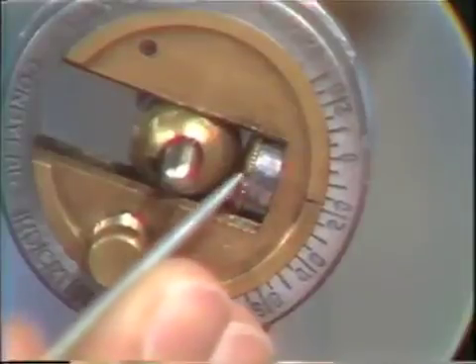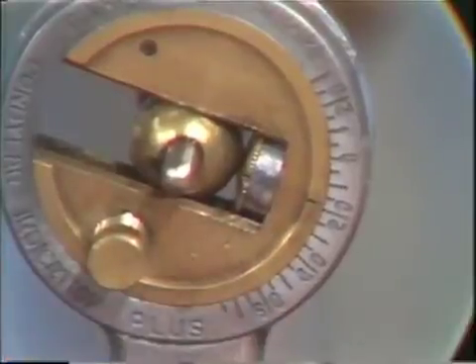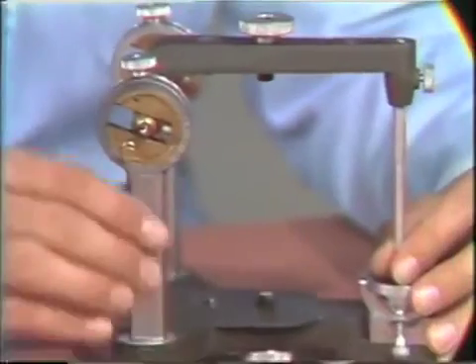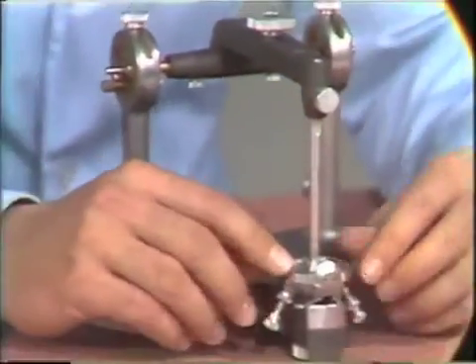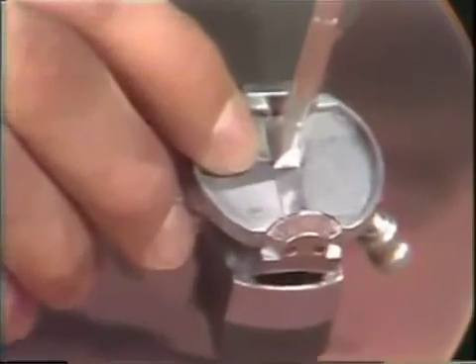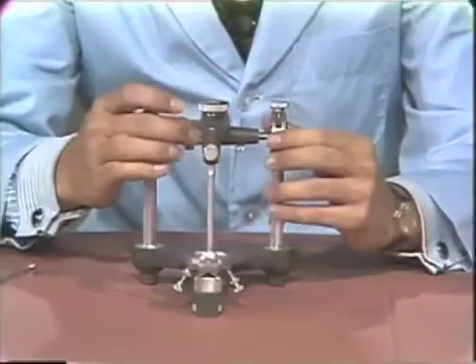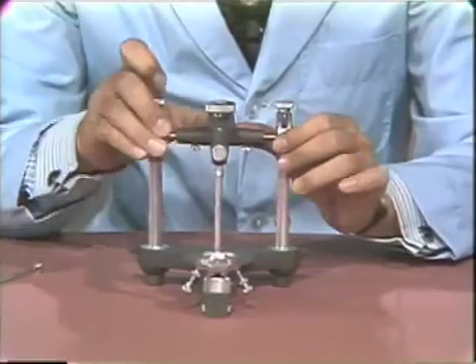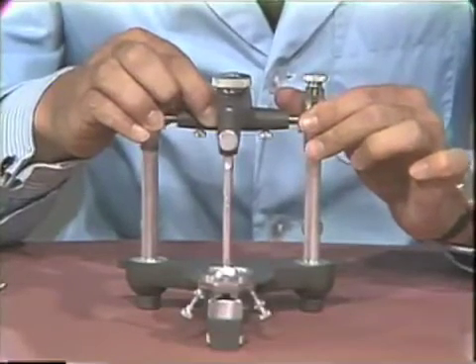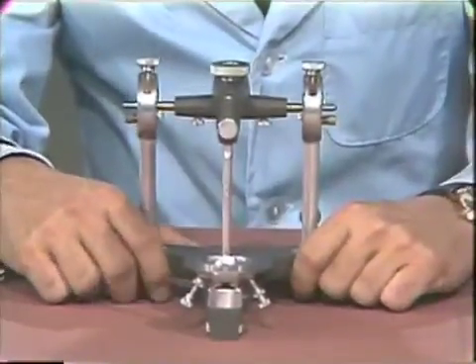This notch in the thumb screw should align with the notch on the condylar element. If we have that position in the condylar area and the incisal pin is centered on the incisal guide table with no lateral play in the instrument — checked by holding the condylar balls firm against the centric stop and moving laterally — and there is no movement, the articulator is aligned and ready to accept the cast for mounting.